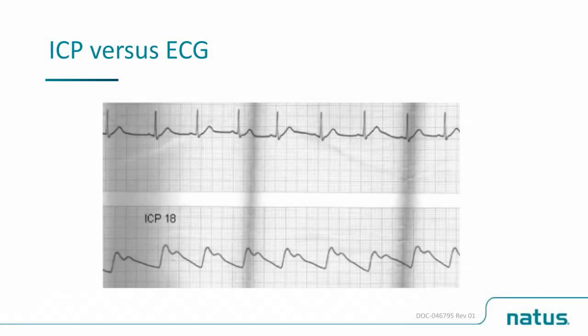The relation to your cardiac cycle is fairly obvious. Remember that your P1 is created by the big push of arterial blood flow into your brain. There should be one ICP waveform for every heartbeat. You will usually see the peak of the P1 wave around the repolarization phase of your ECG.